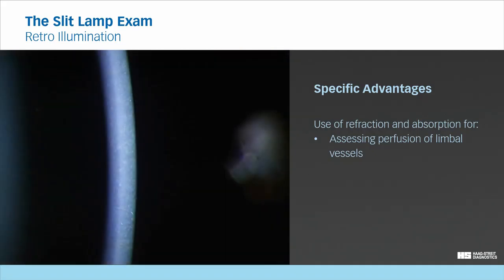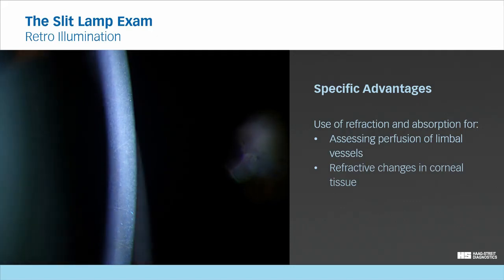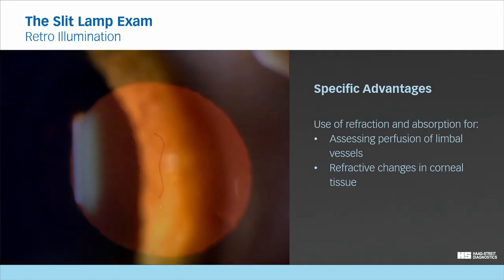In this cornea, direct illumination shows the difference between the anterior and posterior cornea, but it does not illuminate the irregularities associated with the corneal dystrophy. However, when utilizing indirect illumination reflected from the lens, you can observe the refractive changes it has caused in the cornea. When using the retina as the source of reflected light, the irregular refraction in the cornea provides an overview of how the central cornea is affected.